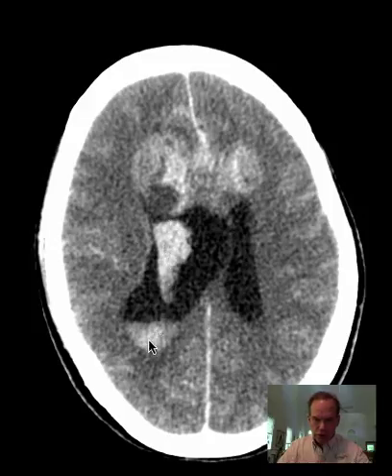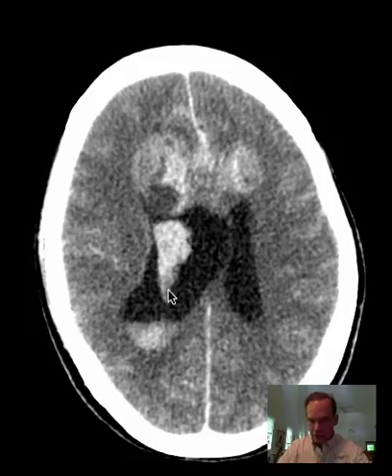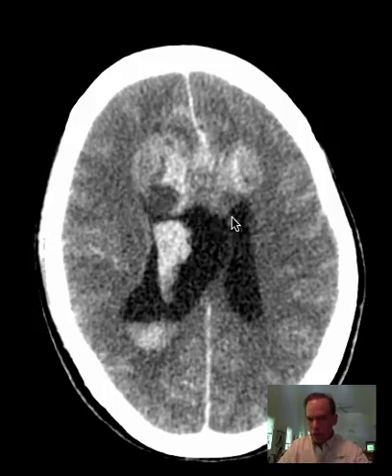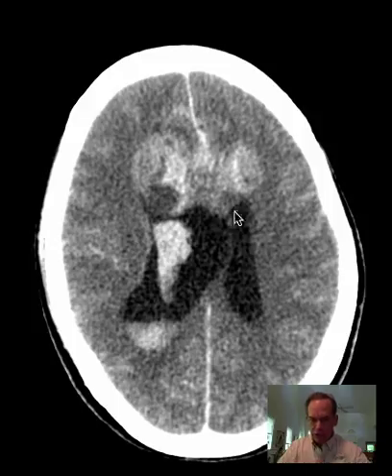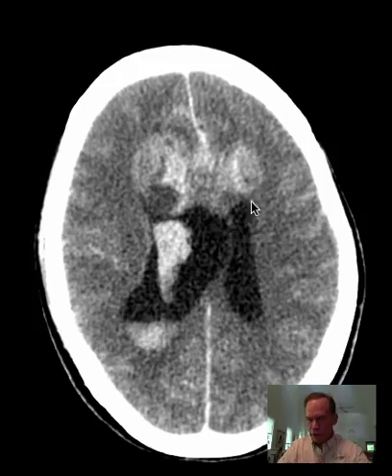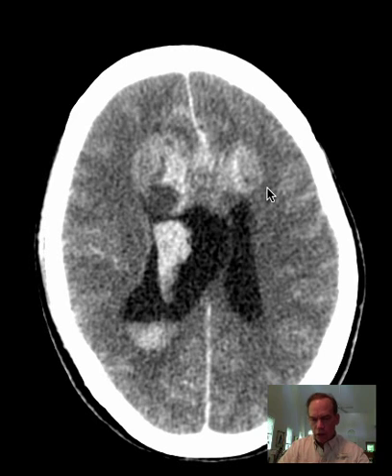Since there is clearly blood — high attenuation material in the dependent aspect of the lateral ventricle with layering — I would suspect this is hemorrhage too, though it's possible it could be a component of the tumor. The tumor has a typical morphology of a glioblastoma extending through the corpus callosum and crossing the midline, and that is called a butterfly glioma. These are almost always grade four, the highest grade glioma — glioblastoma multiforme, called GBM or grade four glioma.